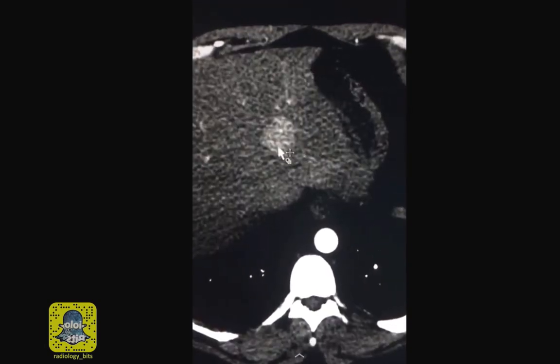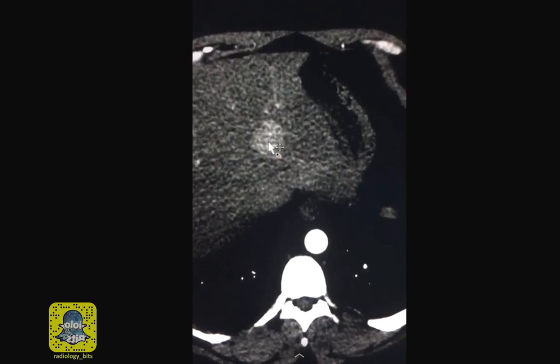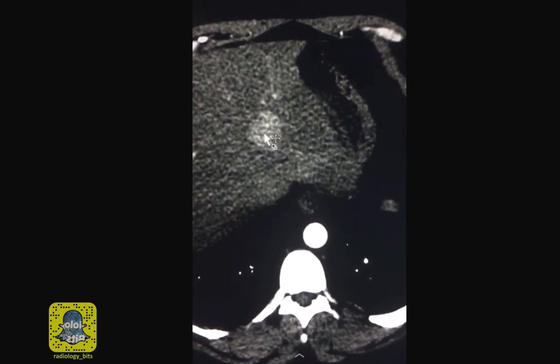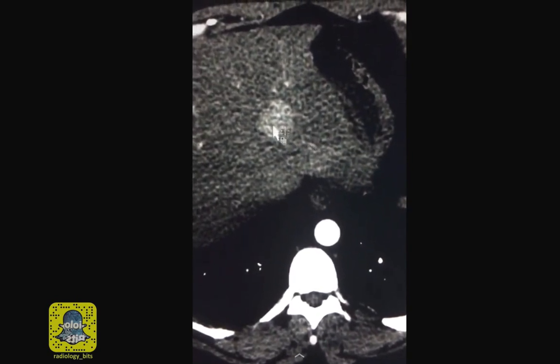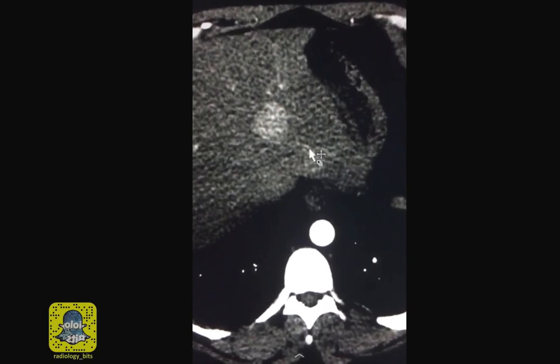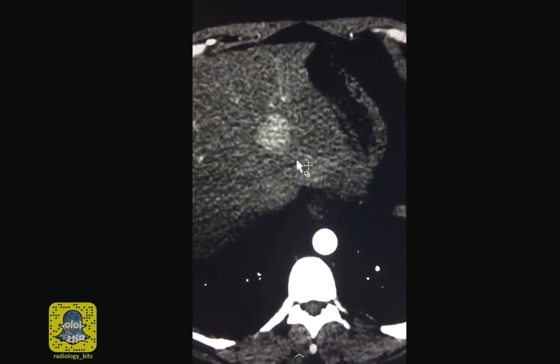This is another lesion that might have a hypodense central scar that would show enhancement on the delayed acquisition, since fibrosis enhances later. If you see a scar, you might think about either the very rare fibrolamellar hepatocellular carcinoma or FNH. A small piece of information for seniors: if you see a scar for FNH, it would be a bright scar on T2 on MRI imaging, while the fibrolamellar carcinoma scar is typically described as hypo-intense and dark on T2 MRI imaging.